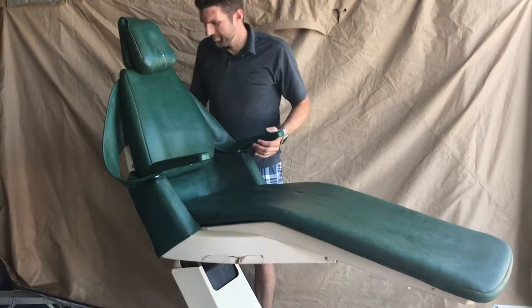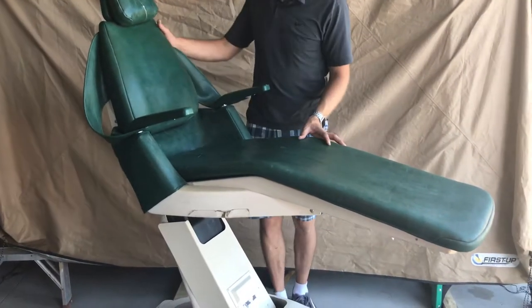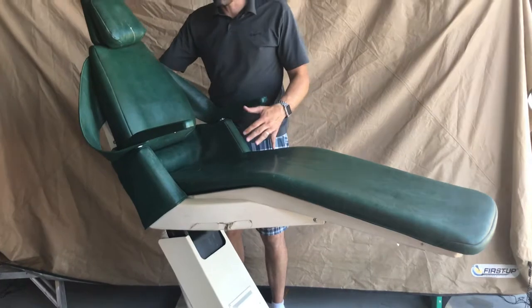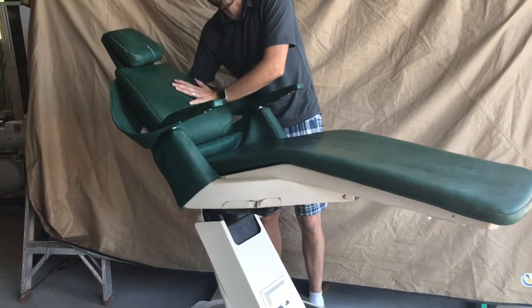Hello, this is chair number 9. We've got a Royal Model 16 again. It is in good condition. Well, the upholstery is needing some help, but the motor function is just great.